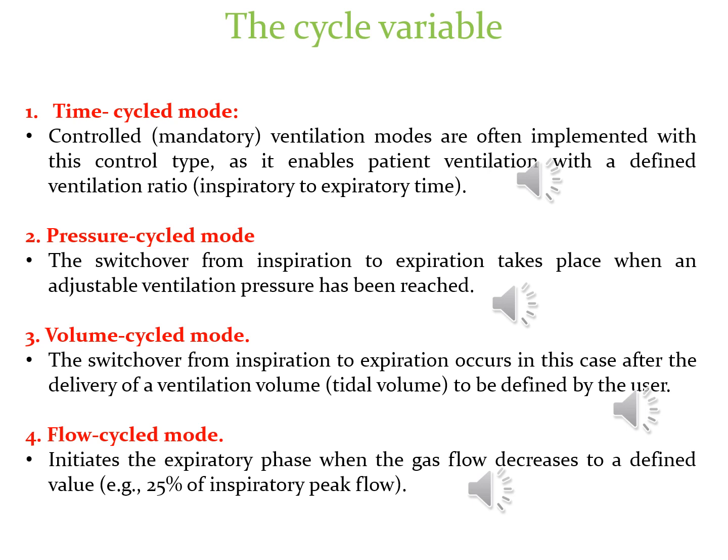2. Pressure cycled mode. The switchover from inspiratory to expiratory takes place when an adjustable ventilation pressure has been reached. Inspiration takes place after a time phase has elapsed, pressure time cycled mode, or by a patient activity and on reaching a trigger criterion. Pressure cycled mode is mainly used with impermissibly high pressure rises in connection with an audible alarm as a safety element.